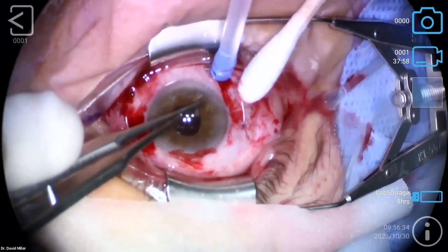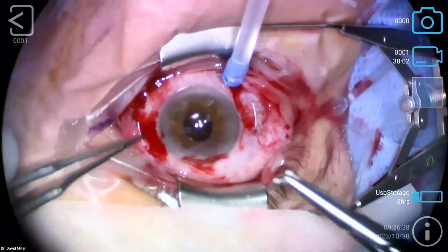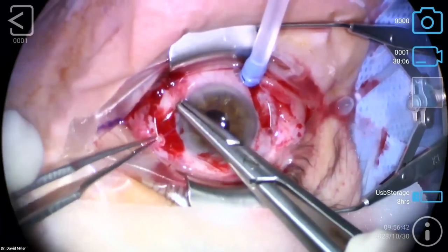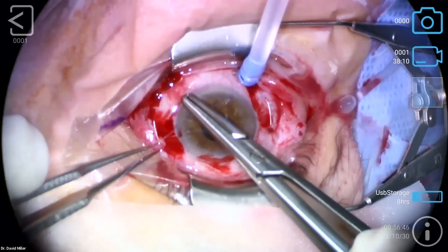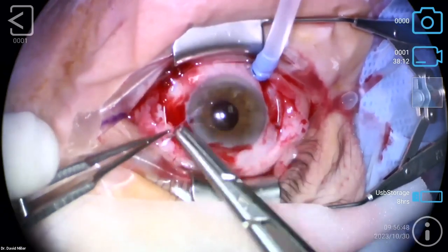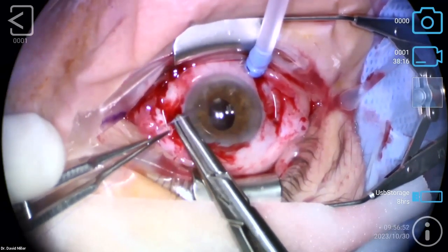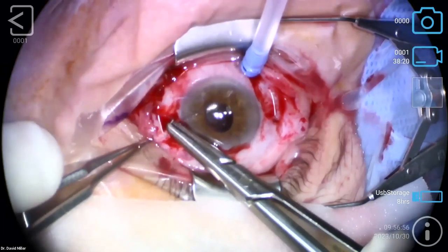Can you tap this one down here? We'll come back to it. It may be leaking a touch. We'll come back to it. It may close up on its own yet. This wound, oriented this way, I'm going to sew it up this way. And again, I think it's very unlikely to hit the Gore-Tex. If anything, I just went deep to it.